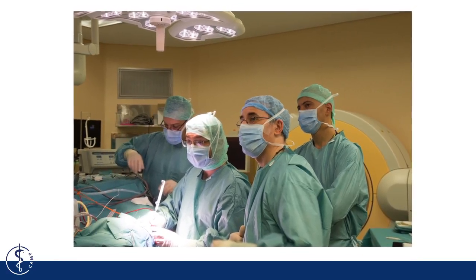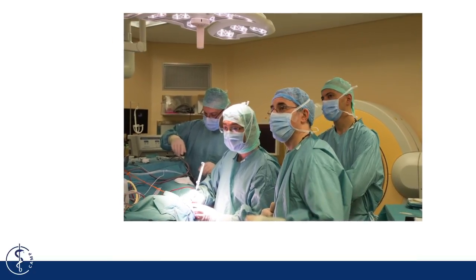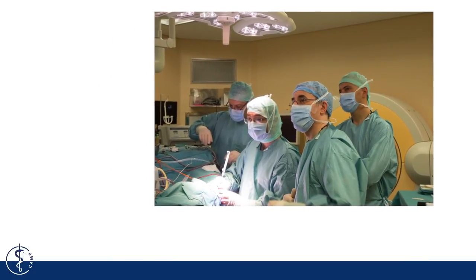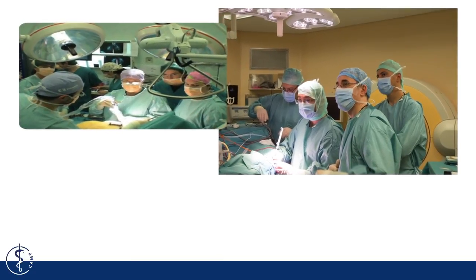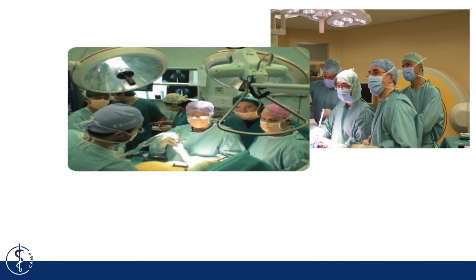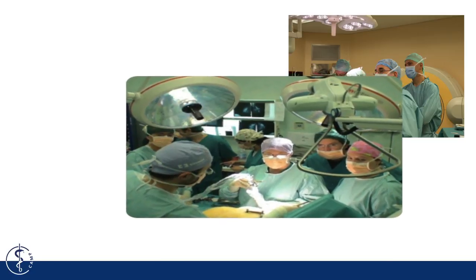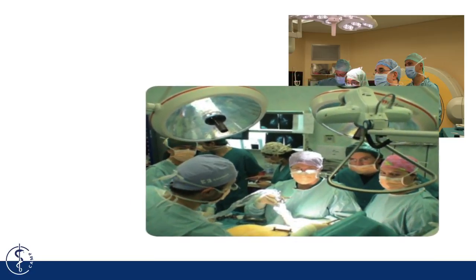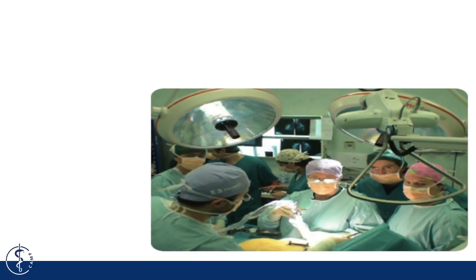Now you have seen the most common nuclear imaging devices: scintigraphy, SPECT, and PET. Providing images for many diagnostic purposes, they have become an integral part of modern healthcare. However, the scanners are usually room-sized and offer very limited possibilities for interventions and operations. So the question is now, how can we translate the principles of nuclear imaging into the operating room?